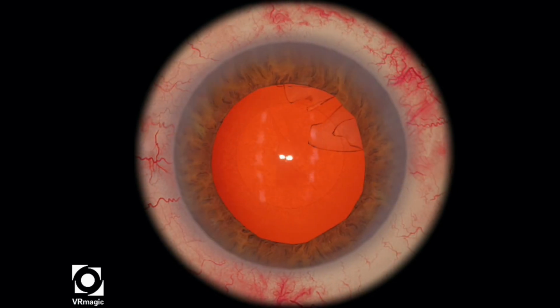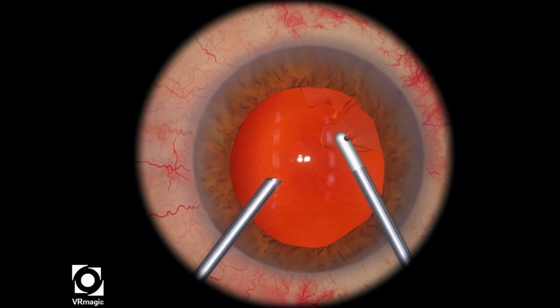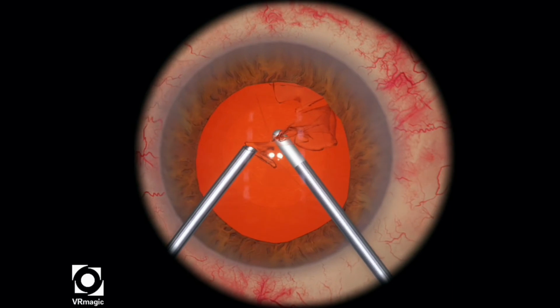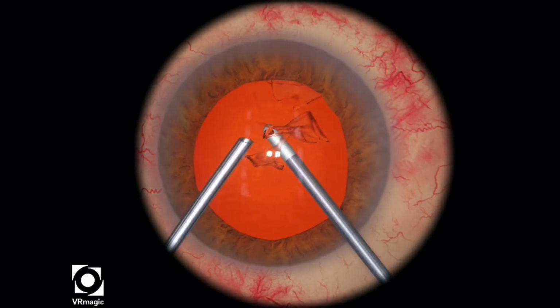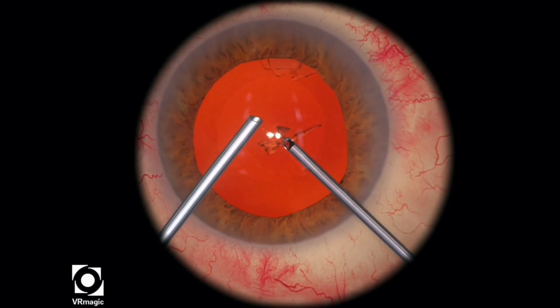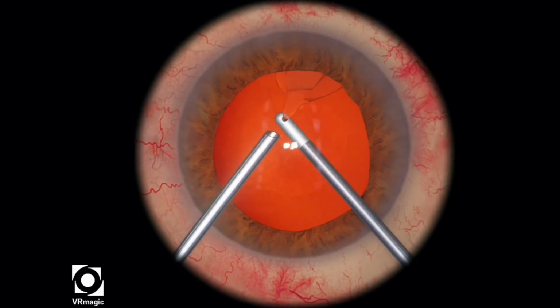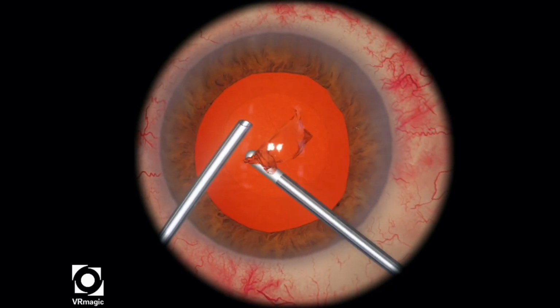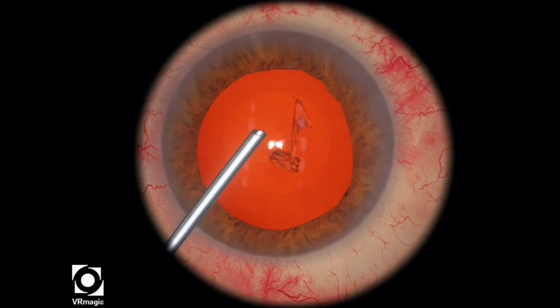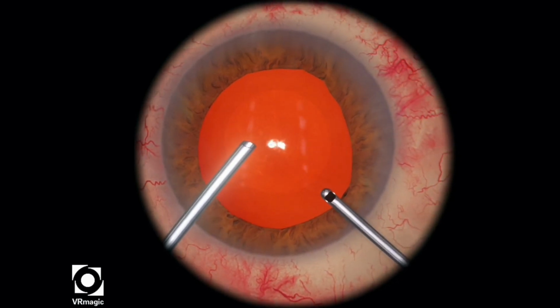Turn the cutter towards the remaining vitreous, and then you may be able to just use high aspiration rates to suck those pieces of vitreous towards your cutter and eventually get rid of it. So here again, I'm using my technique where I have a very low flow rate and low bottle height. I bring the pieces of the cortex to the center, and then I use the vitrector, not the aspirator, to get rid of the cortex piece. Then I'm just using my cutter here. It's pretty much done.